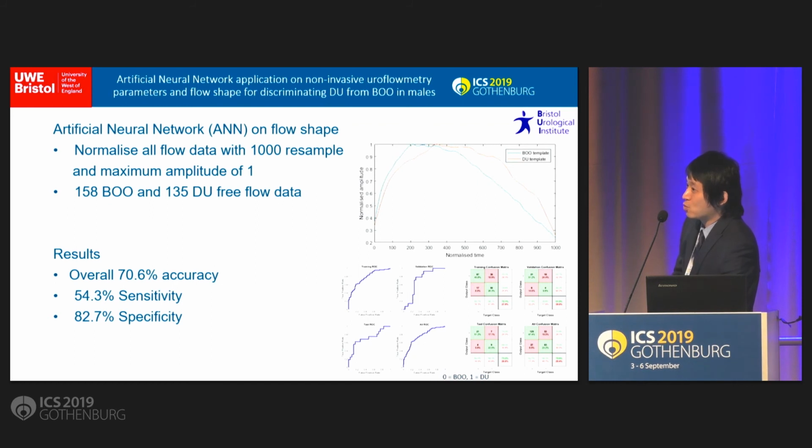But you said you didn't try to normalize on volume because you didn't find any volume weighted difference between the two groups. Well, some of the work that we've done with flows shows that if you volume correct your flows, you can see significant differences in flow characteristics. So I would probably recommend that you try normalizing for volume. Yeah, okay. I will try it.